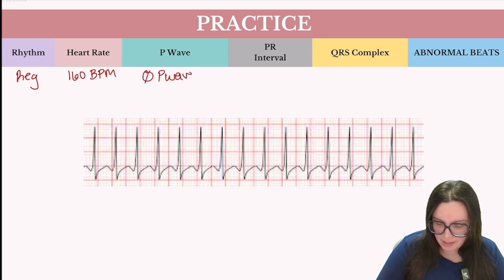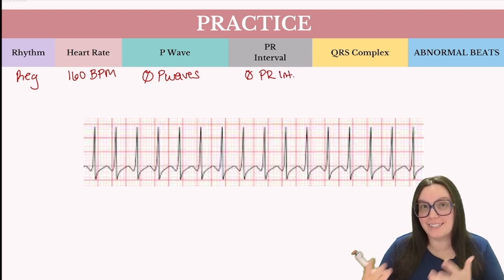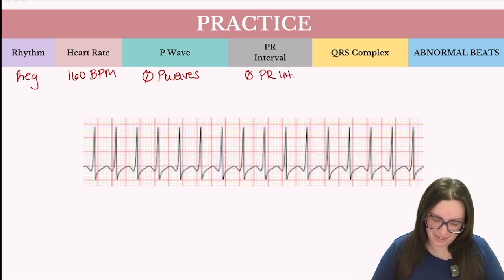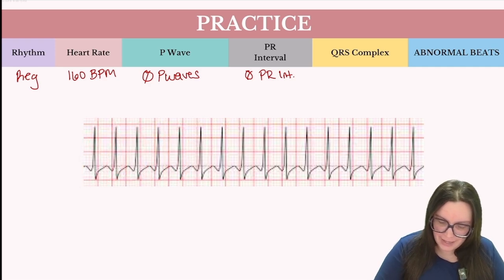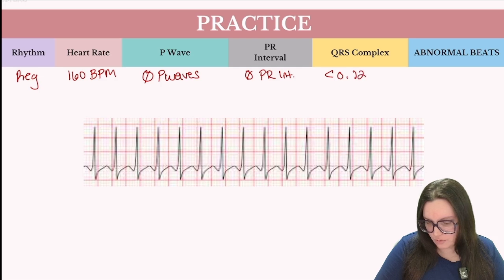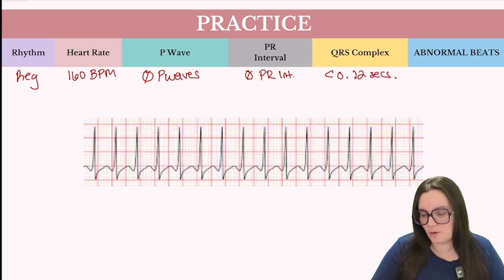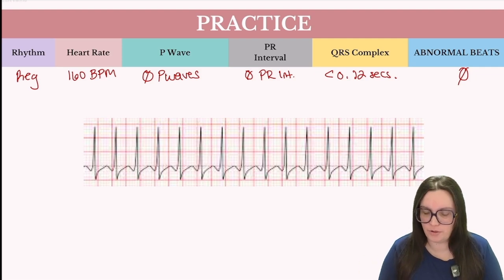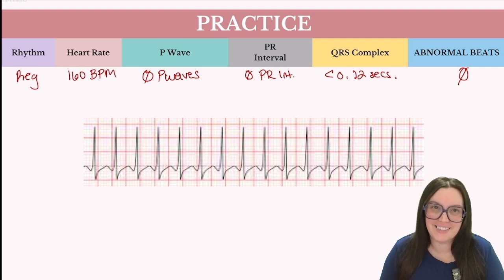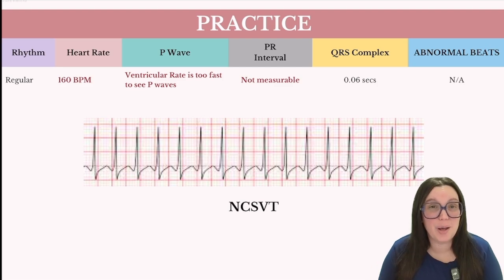Because we don't have P waves, we're also not going to be able to measure our PR interval. Is our QRS complex narrow and normal, or big, wide, and ugly? In this case, it's very, very narrow — less than 0.12 seconds. There are no abnormal or premature beats. Anytime we have a rhythm originating at or above the junction, we're going to see a narrow and normal QRS complex. The correct rhythm is narrow complex supraventricular tachycardia.